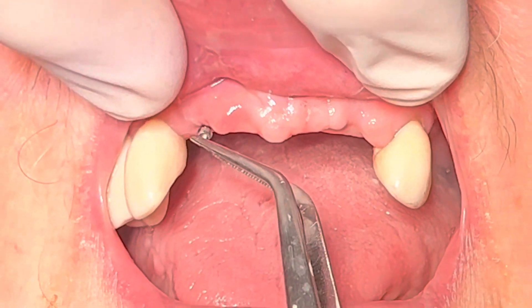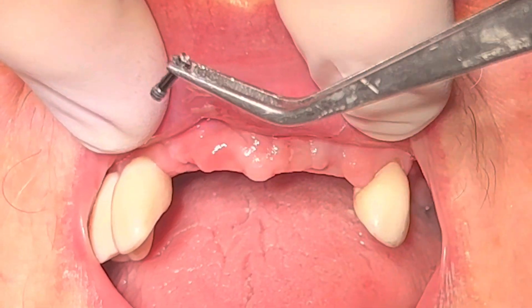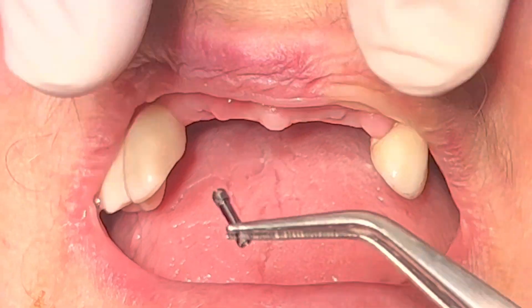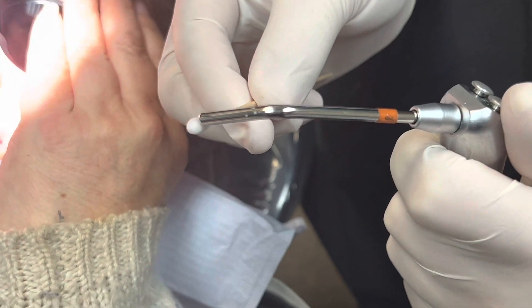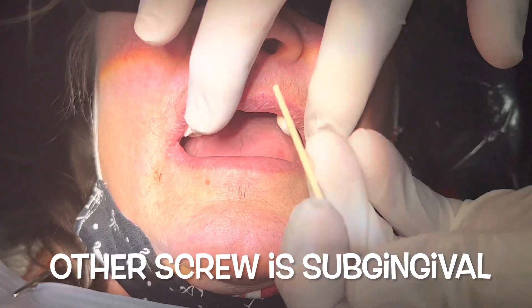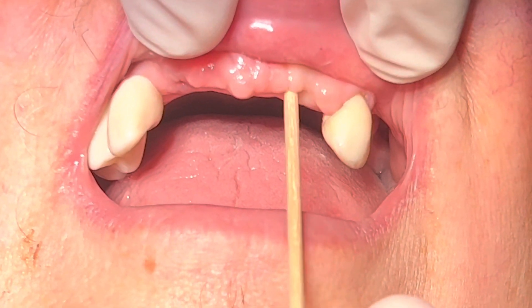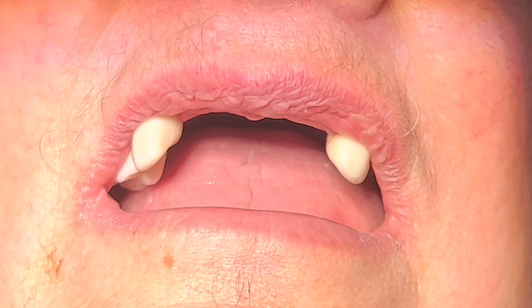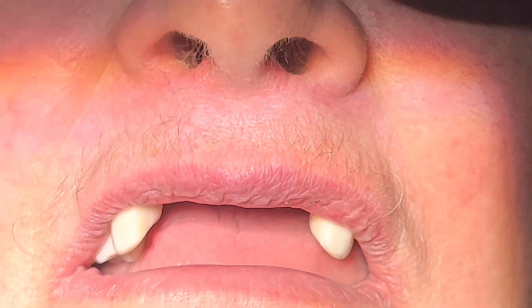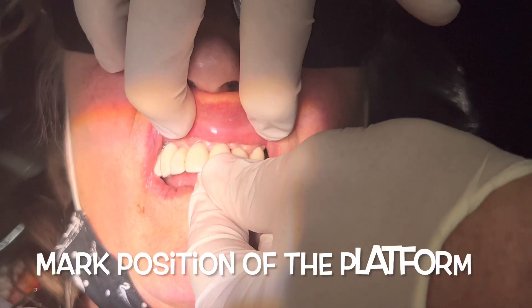Here's my tool — I'm using the fuzzy cotton tool, which you can also get for COVID testing. You can see that the first screw came up pretty easy. We wet the cotton swab, applied it to the end of the screw, and turned it — that gets the screw out because this screw is not under tension. Now we're going to use the other end of the COVID stick to go in and get the buried screw out, but you can't get to the implant, so this will require a little more thinking.